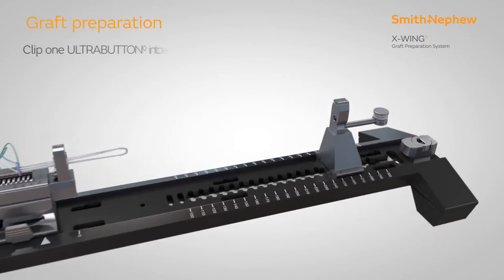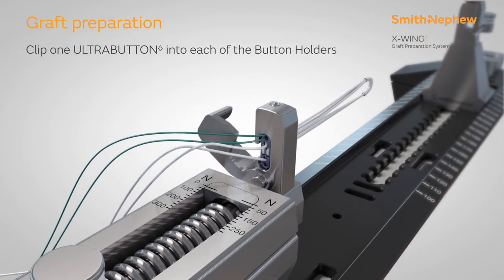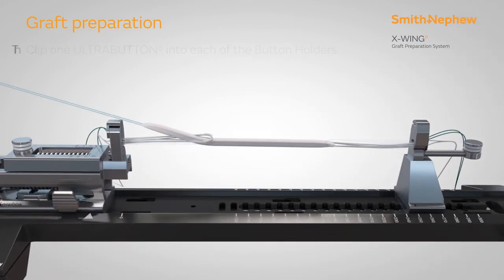Begin preparing the graft by clipping one ultra button into each of the X-Wing button holders. The adjustable loops should face towards the centre of the tensioner. Thread the tendon over the first ultra button and whip stitch the free ends together with mini tape loop suture on needle.